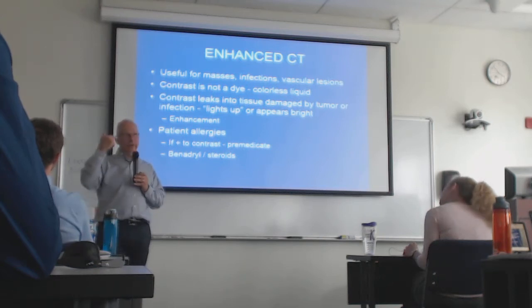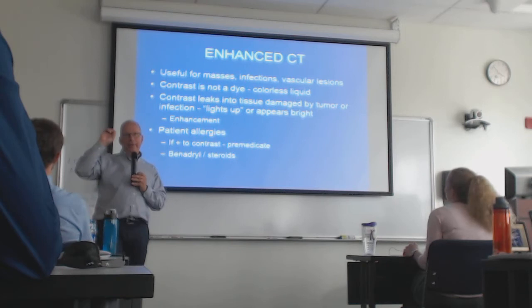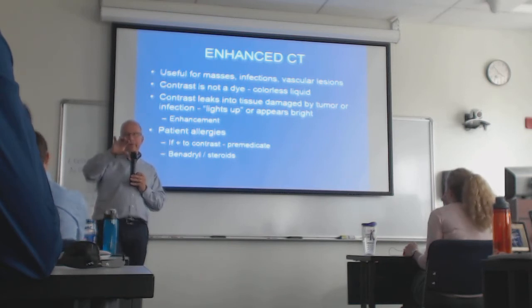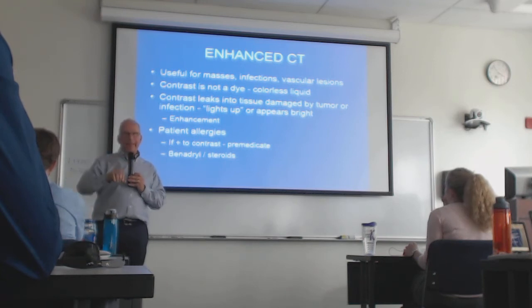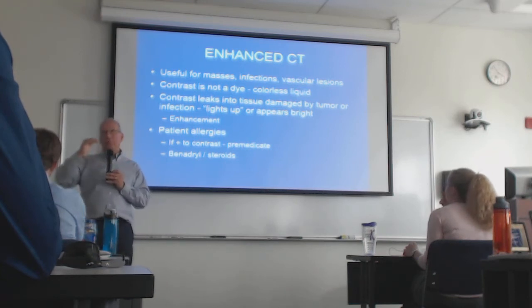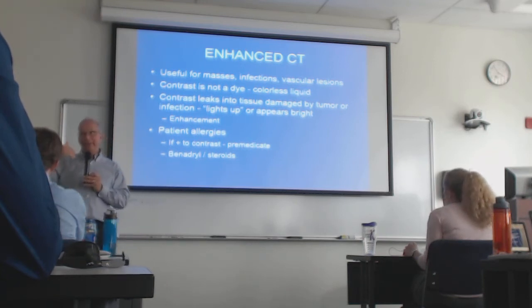So those X-ray photons coming from the CT scanner tube are encountering those iodine atoms in your bloodstream, and it's causing your blood to look more and more dense on the CT scan. So that's why we use IV contrast.